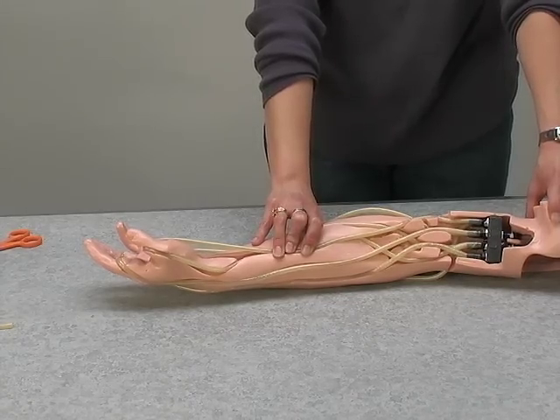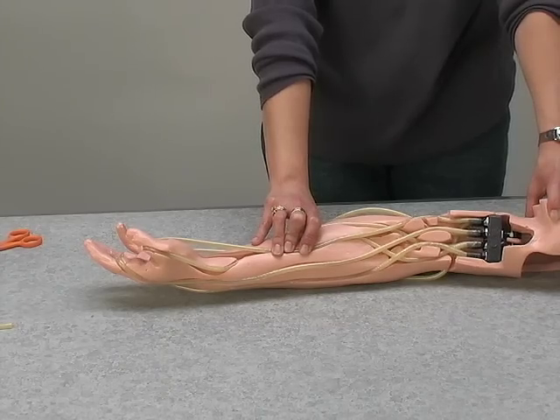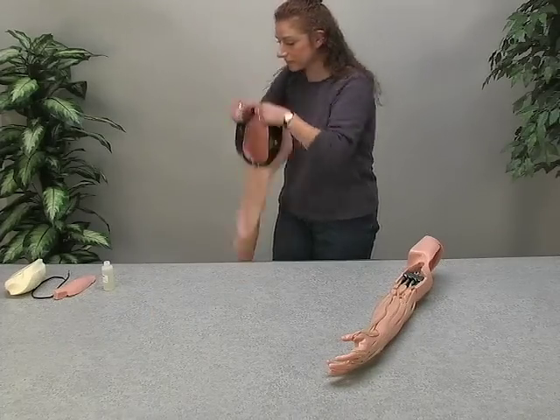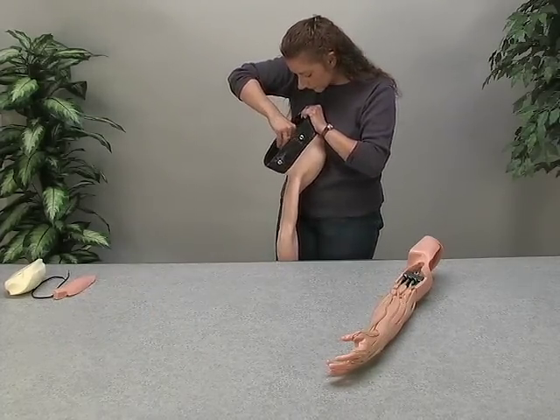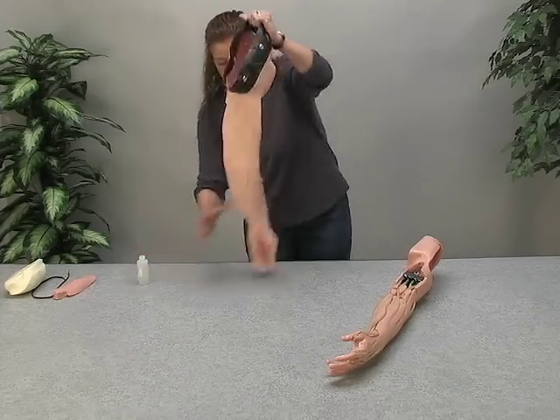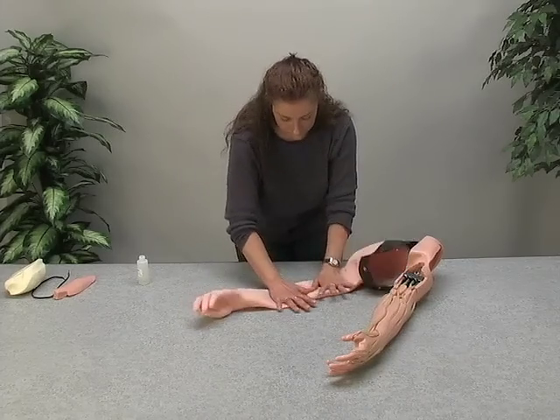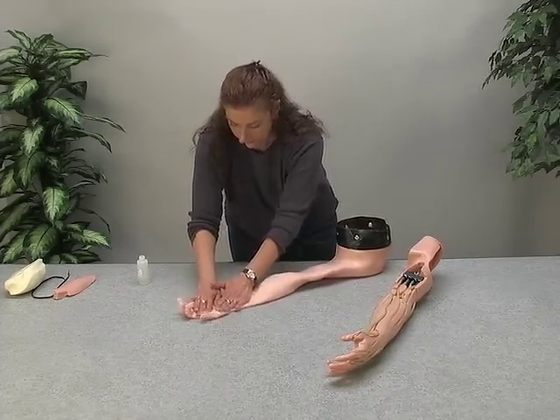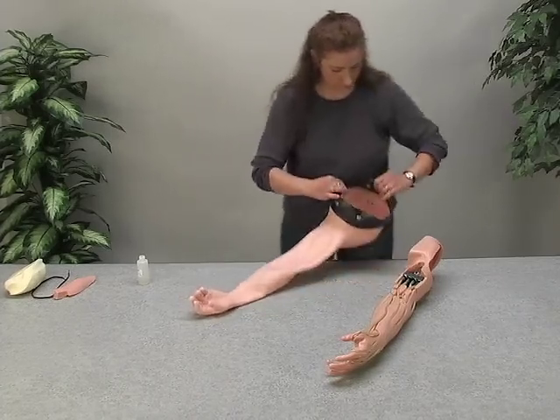After successfully installing the replacement veins in the arm, you are now ready to install the replacement skin. First, pour the remaining lubricant into the skin, allowing it to run down the sides. Massage the lubricant, working your hands back and forth and up and down to coat the inside of the skin completely.